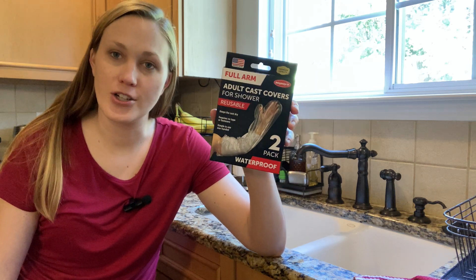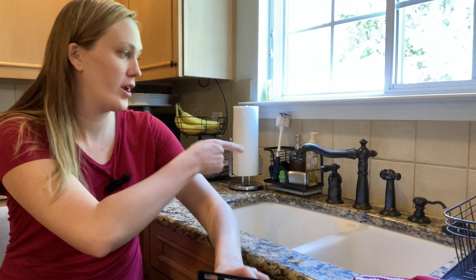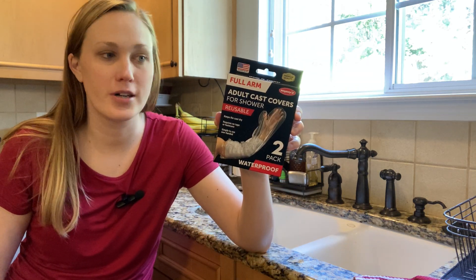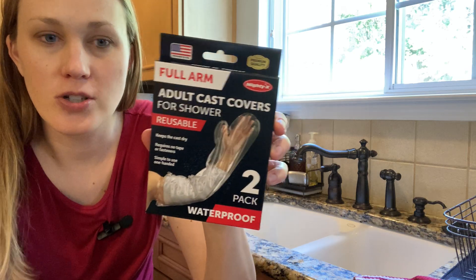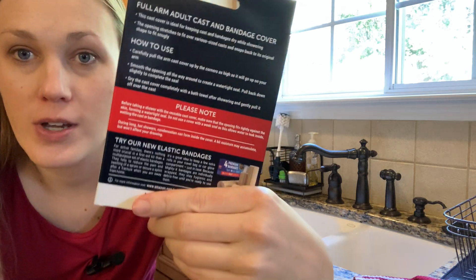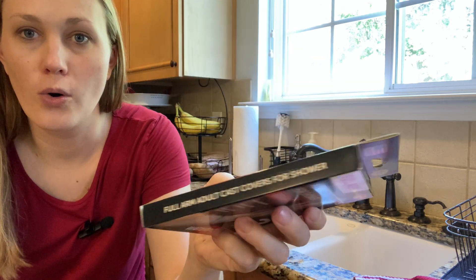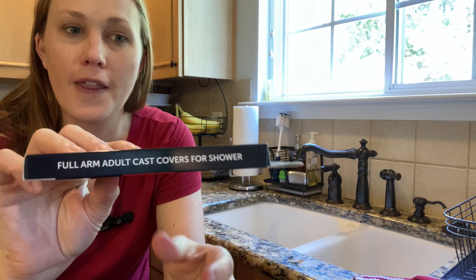While I obviously cannot show you this in use in the shower, we're going to do the next best thing and spray the heck out of it with my sink sprayer. So this is what the box looks like — feel free to pause and read the packaging there if you'd like. Not a whole lot on the sides. That's the packaging.